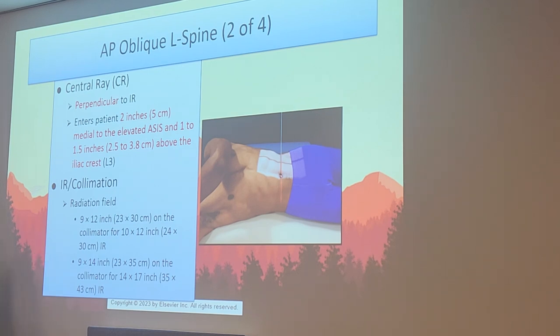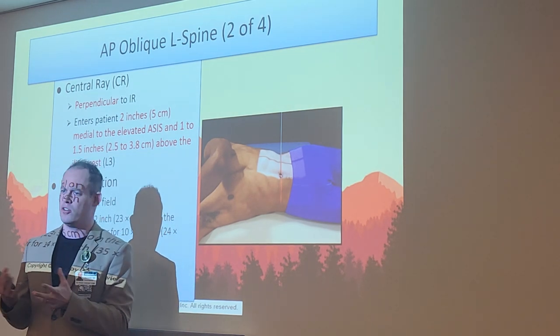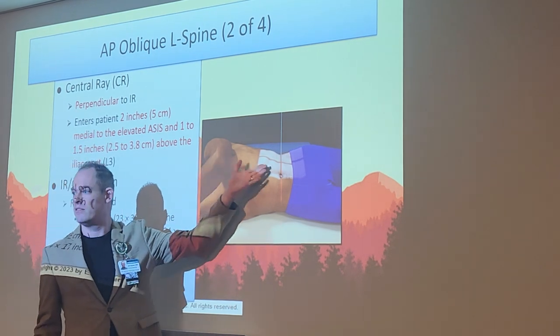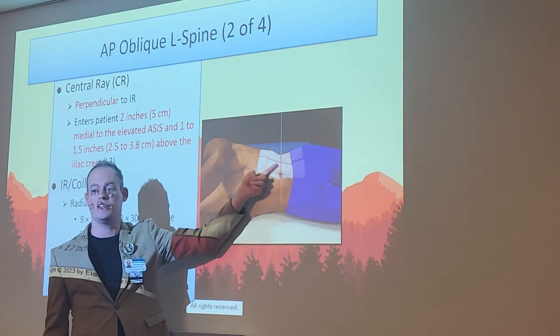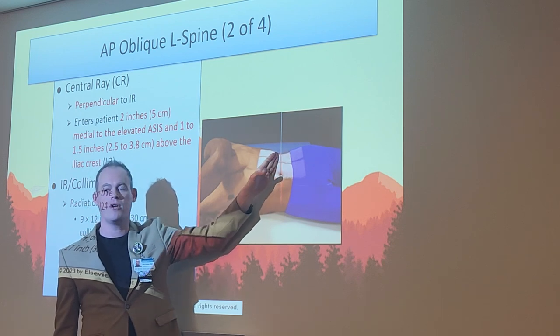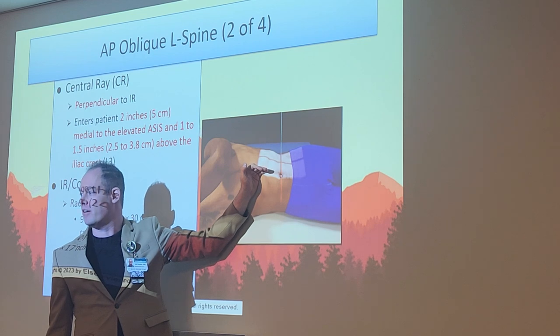Now, one thing you can use, guys, on your patients, and this is where you kind of use that x-ray vision because you don't need to be exposing your patient's chest, but use the nipple line for that vertical line. That's where you center. The nipple line is the centering point. Does that make sense? So 1.5 inches above the crest, along the nipple line, that will be towards the elevated side in the proper area.